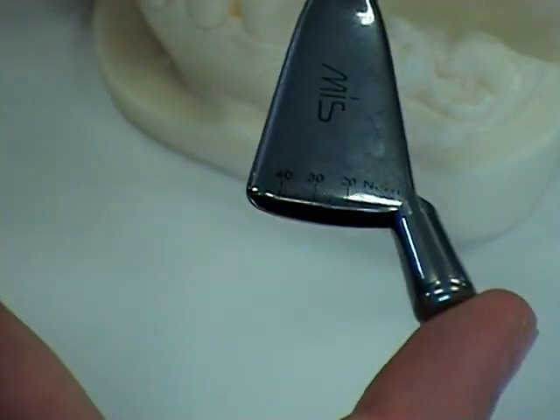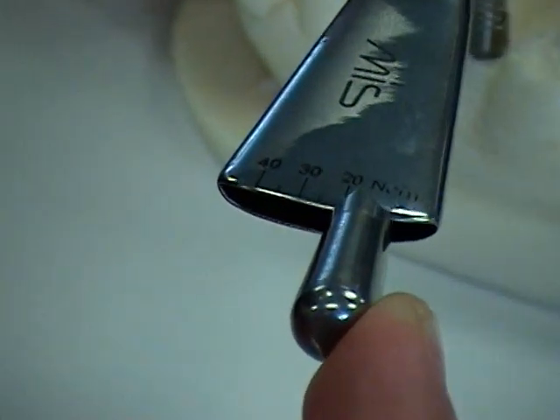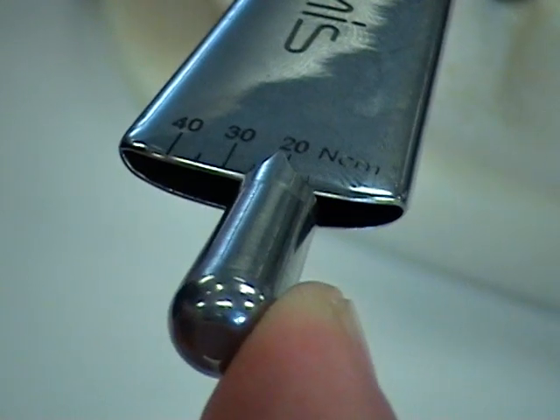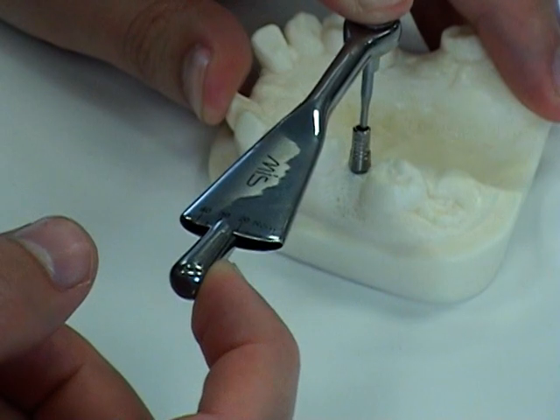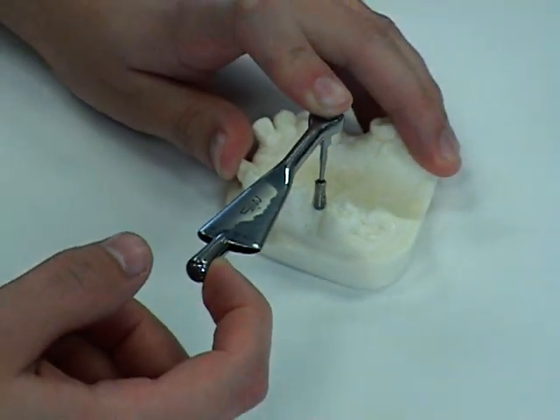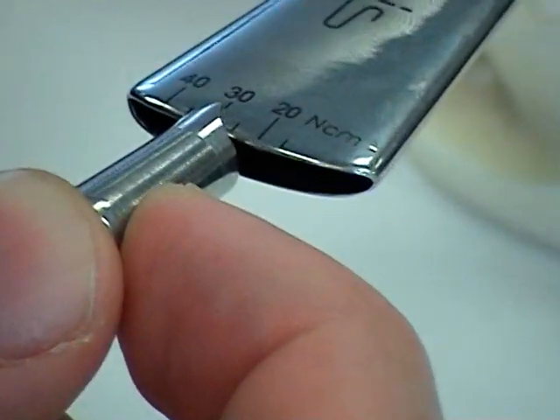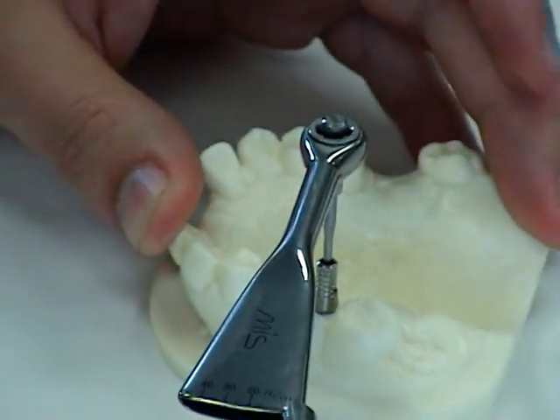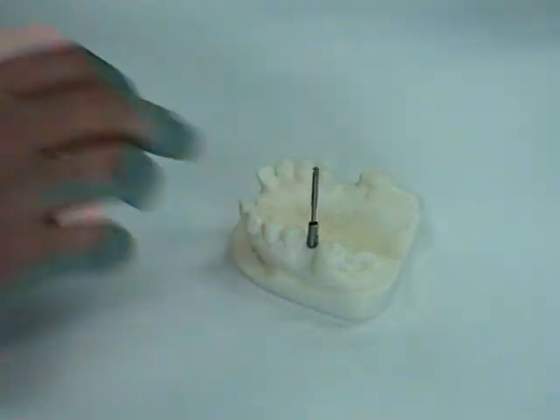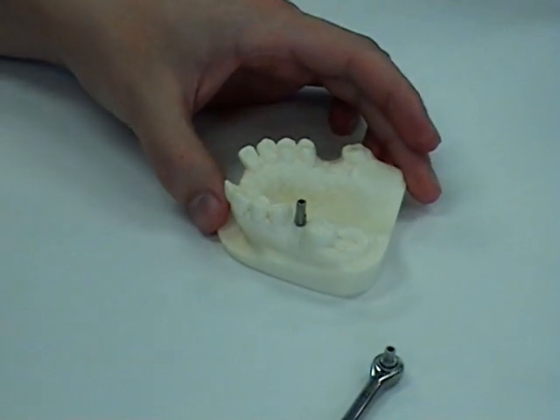We push only with the outer part, and you'll see the outer handle moves to show how much torque is being applied. Once the wrench starts to move, you'll know you've reached the torque rating for the screw. The reading says 28, so I'll push a little bit more — you'll see that it tightens to 30. We can stop here knowing the screw is tightened to 30 newton centimeters. Remove it, turn the driver, and the abutment is now torqued.